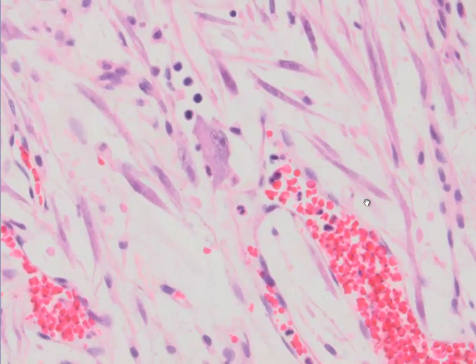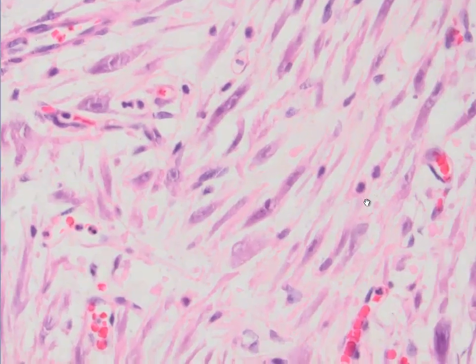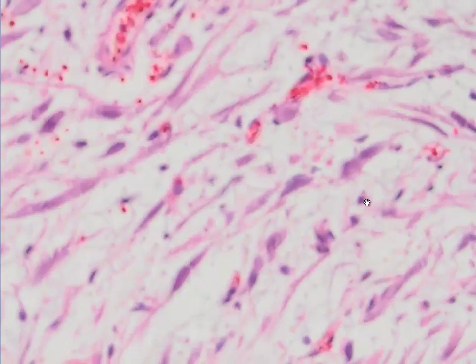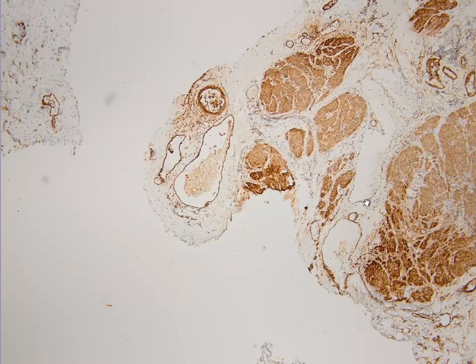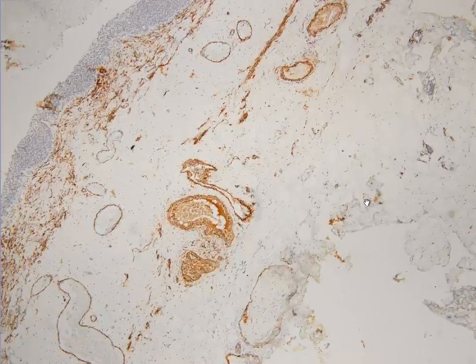Another one is here, and the cells look like myofibroblastic, or let's say maybe rhabdomyoblastic. These cells could be seen also in botryoid rhabdomyosarcoma, and therefore we did a desmin staining here, and it was negative. And this is one of the stainings that leads to the diagnosis.